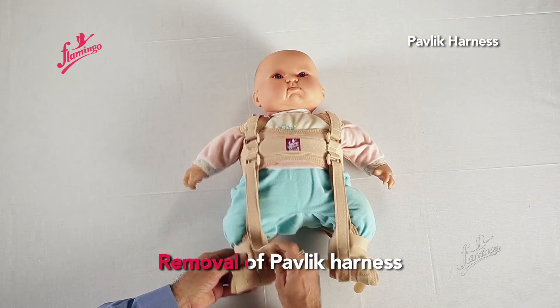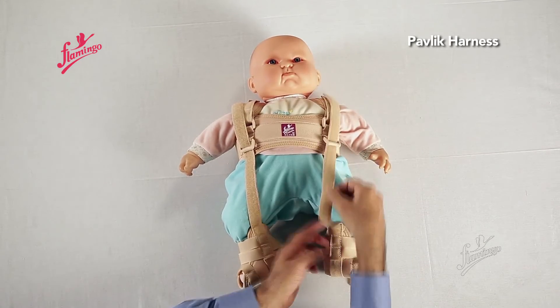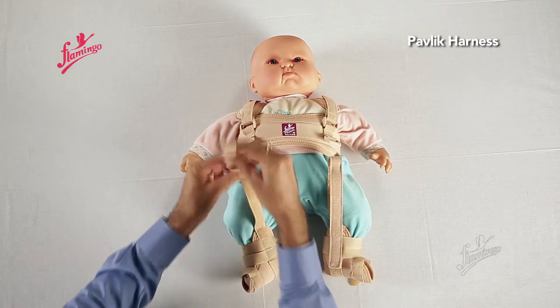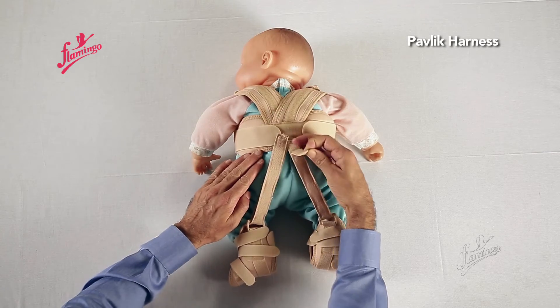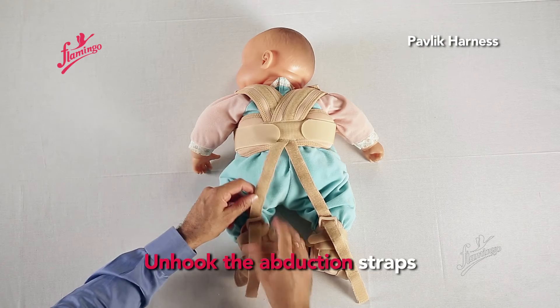Removal of the Pavlik Harness. Unloop the flexion straps. Turn the baby gently. Unhook the abduction straps.